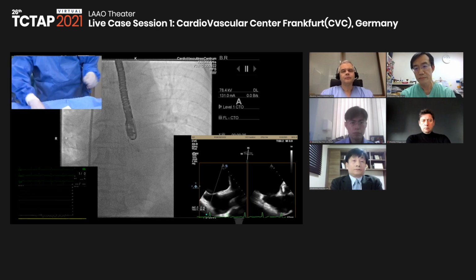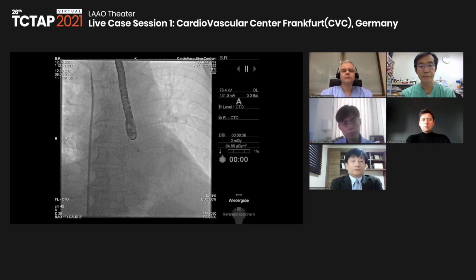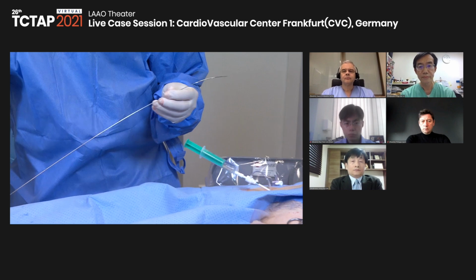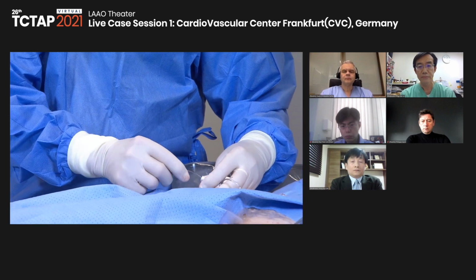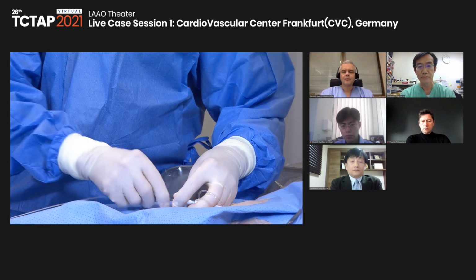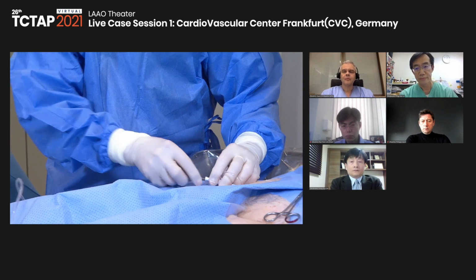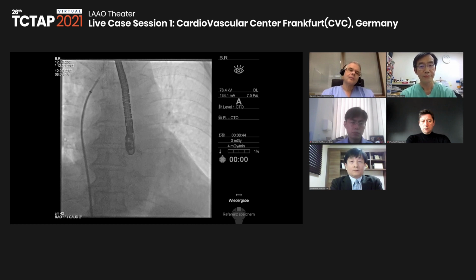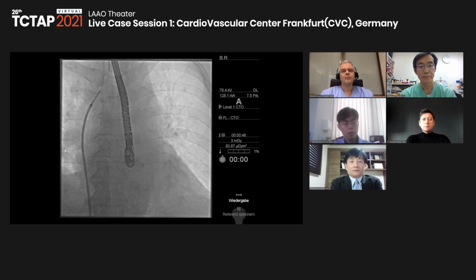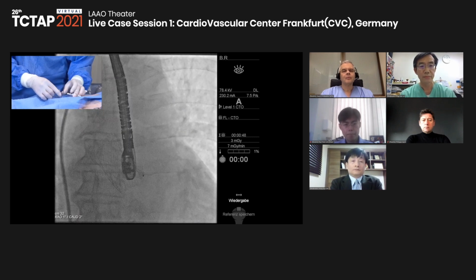So now the sheath is in the superior vena cava, and I will insert the needle. Judith, I will need the long axis bicaval view of the septum, and thereafter I will explain. He needs more sedation, Selina. Okay. So the needle goes up. I keep a distance of about a finger between the hub of the dilator and the needle. I go to 6 o'clock or 5 o'clock with the arrow on the needle. And now I'm coming down.